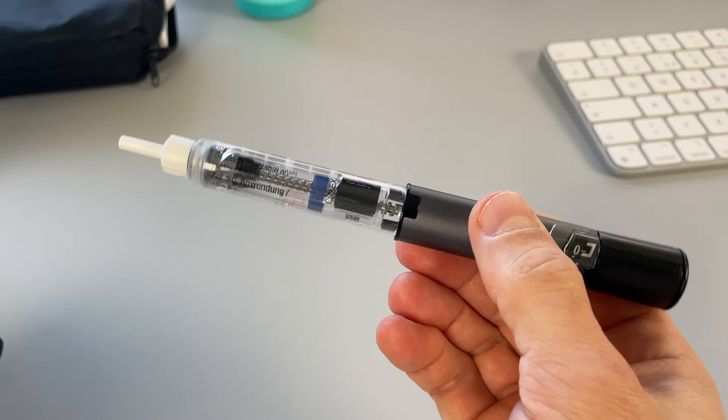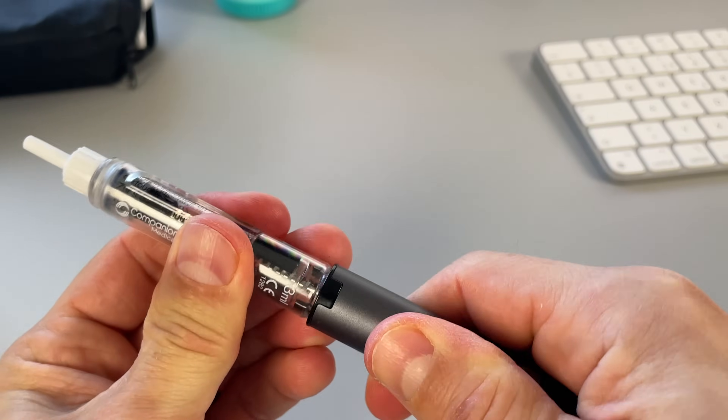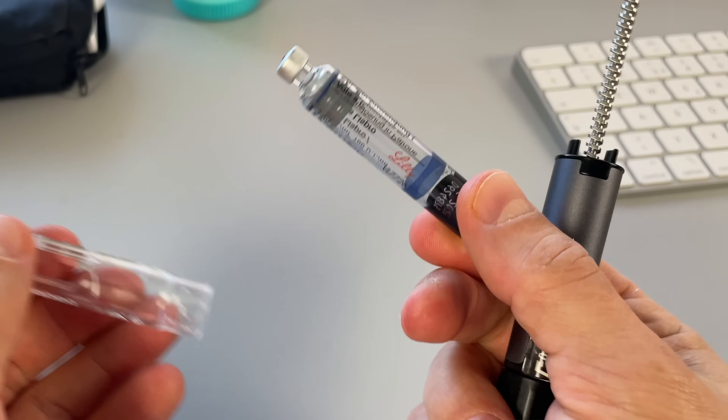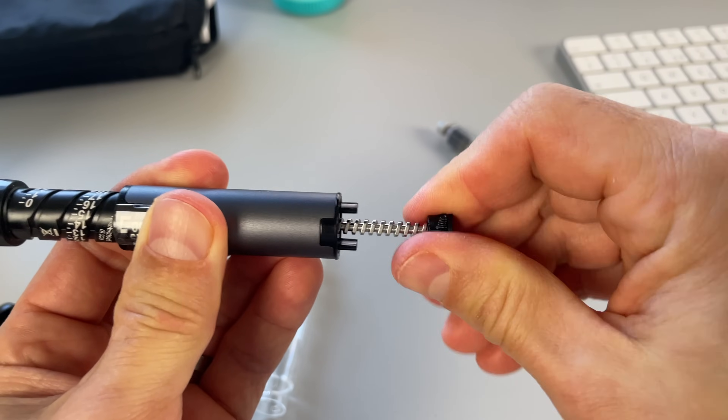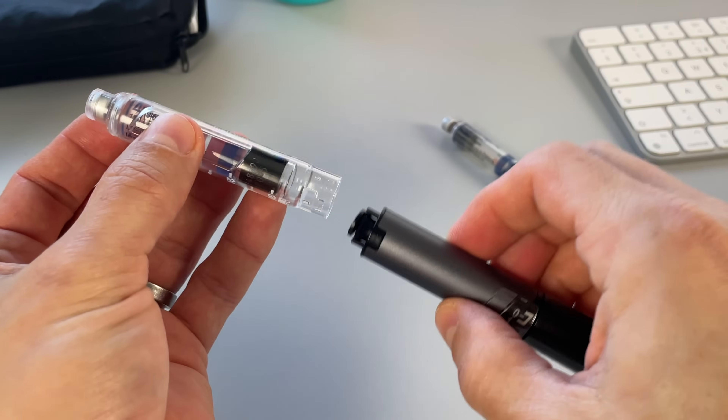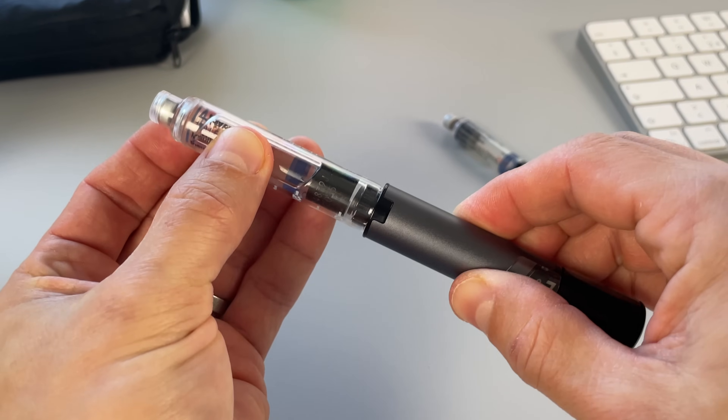Big thanks to Medtronic for making this video possible. The smart insulin pen I'm talking about is called InPen, and you can use it with most rapid-acting insulin cartridges. The InPen is reusable for up to one year, so whenever one vial is empty, I take it out, rewind the metal screw, and pop a new vial in. Another advantage of InPen is that it lets me dose insulin in half-unit increments.